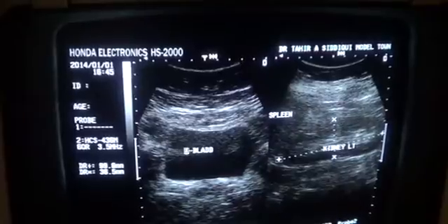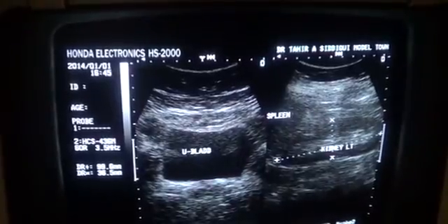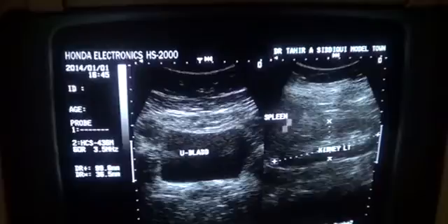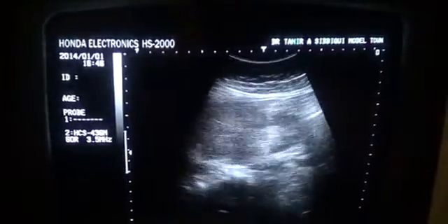This is the urinary bladder in transverse section. Now I am going to show you the right kidney.